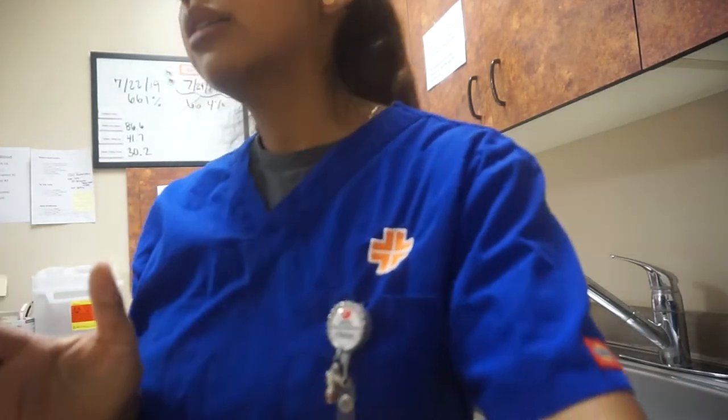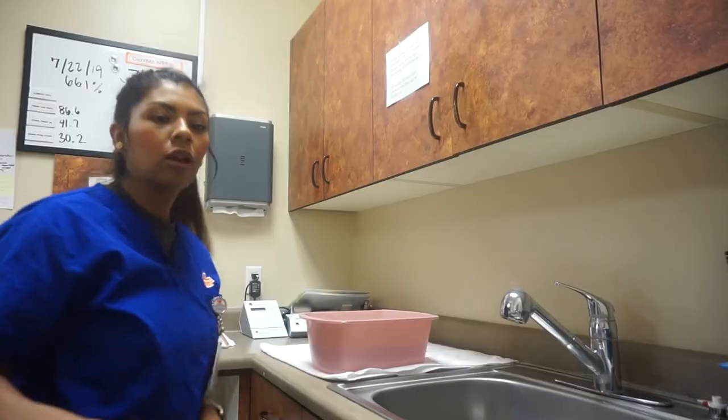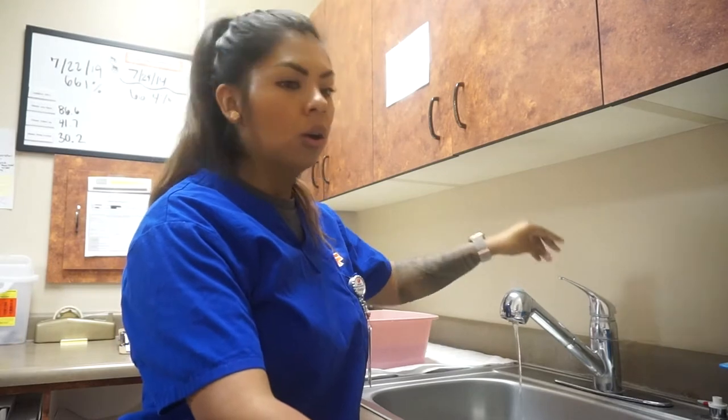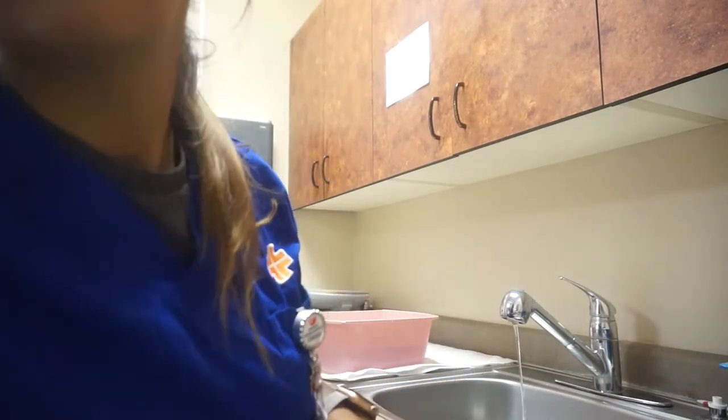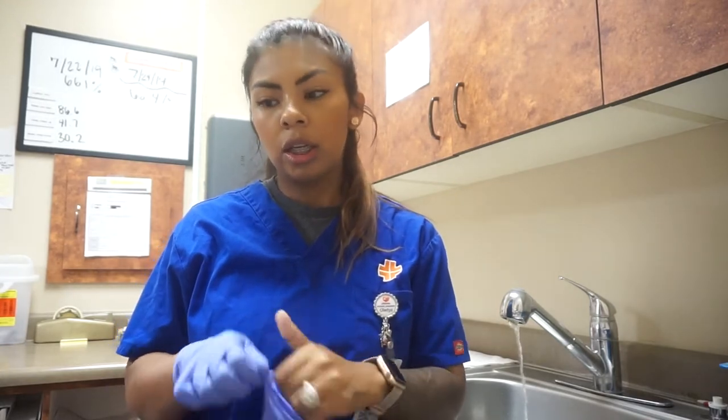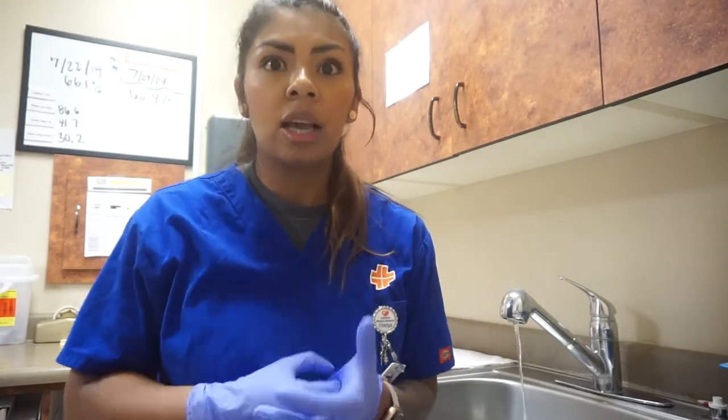So I like to just have my instruments sit in that detergent for a couple of minutes, and then I'll scrub. I like to use gloves — I don't like to touch anything without gloves, like blood, even if it's in tubes. And detergent — like, everything causes cancer nowadays.